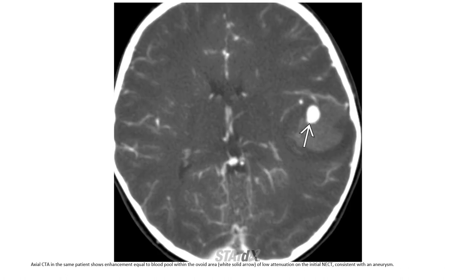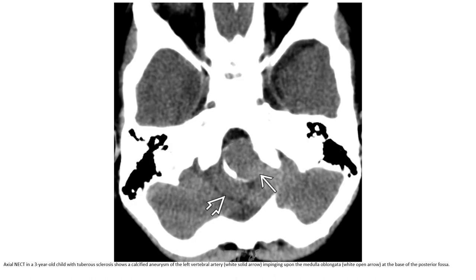CTA in the same patient shows enhancement equal to blood flow within the ovoid area of low attenuation seen on the initial non-contrast enhanced CT, consistent with an aneurysm.